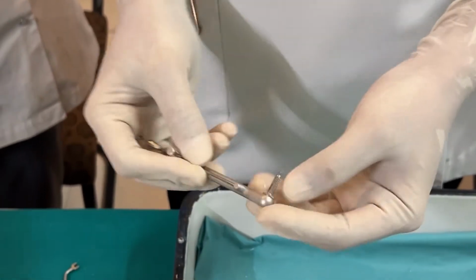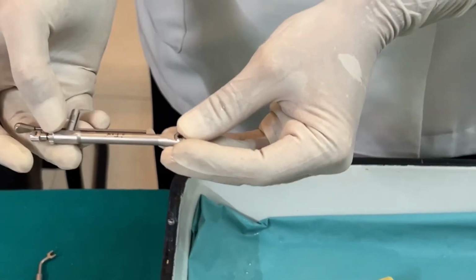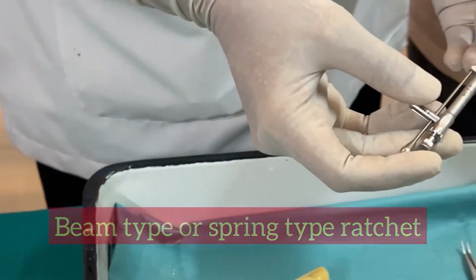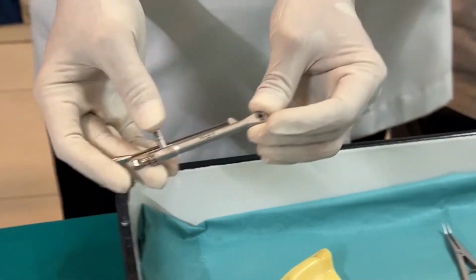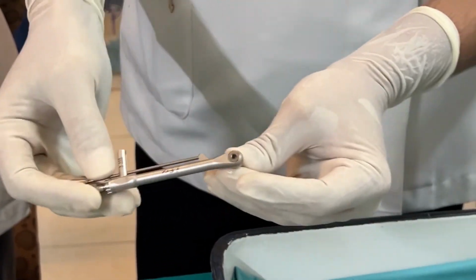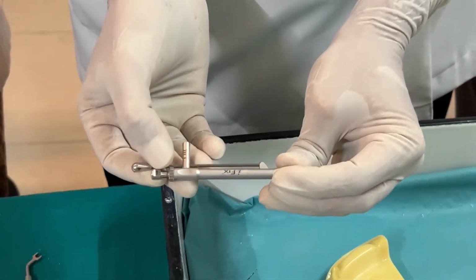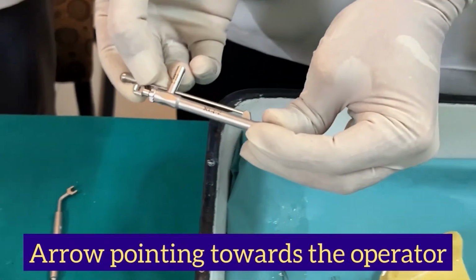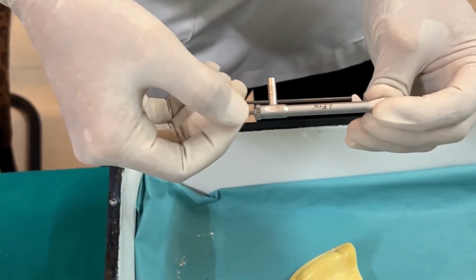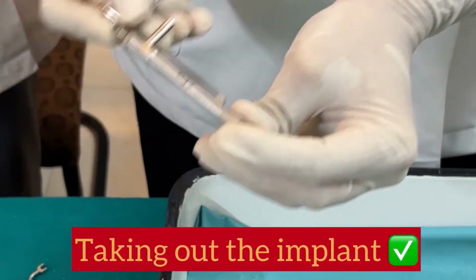So once you have engaged it into the torque ratchet, this is one thing which was demonstrated last time also. This is basically the beam type or the spring type of torque ratchet. Torque ratchet is the most expensive instrument in the implant kit, and the basic purpose is that we should be able to tighten it with a certain amount of force as such. Okay? As long as the arrow is pointing towards us, that means we are tightening the implant, inserting the implant, and suppose we were to rotate it and the arrow is pointing away from us, that means we are taking out the implant.